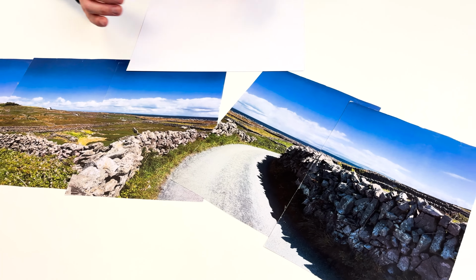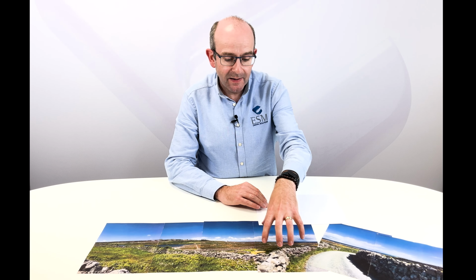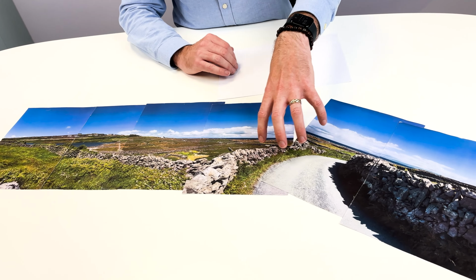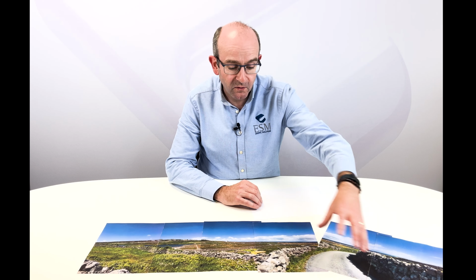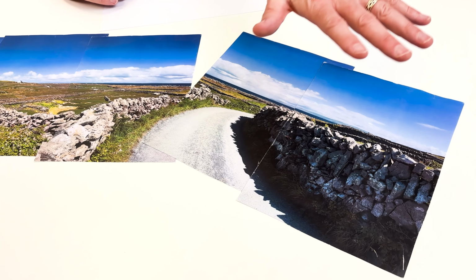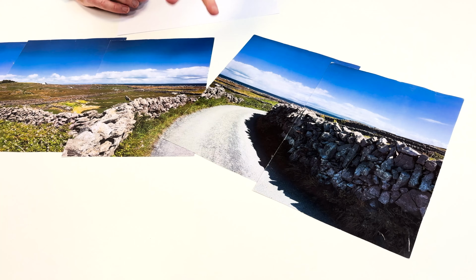Then what could happen, in a combination of which step happens first, is that we come back to here, we start scanning, we start capturing more information, and we end up adding on information in a different path, i.e. in the correct path. So we could go in the correct path initially and then end up going offline, or go offline first and then go in the correct path. What happens in that situation is we could end up with two sets of data, maybe overlapping or maybe going off on a different tangent. It's something to watch out for.